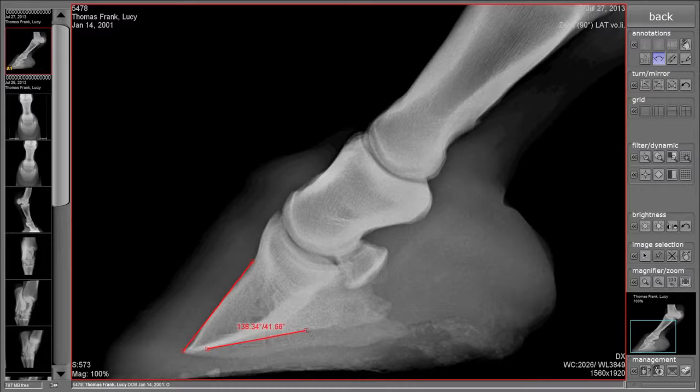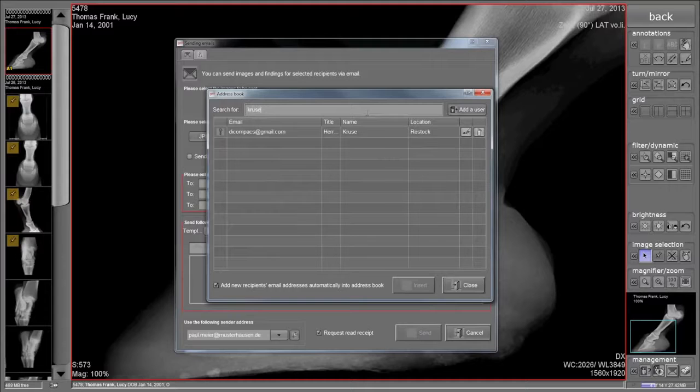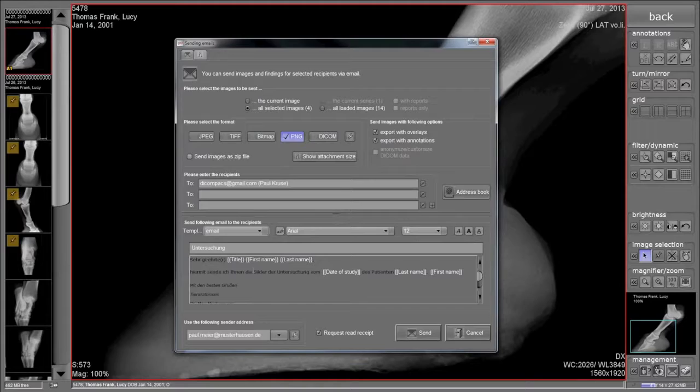The integrated email function allows images to be sent in different file formats directly from DICOM PACS DXR. No additional email program is required. The integrated address book simplifies choosing the recipient. In addition, various email templates can be stored.